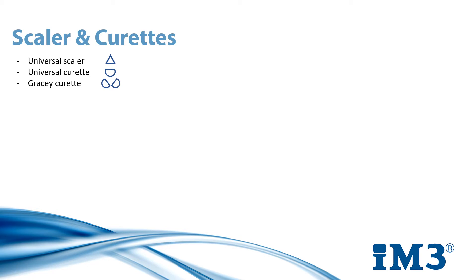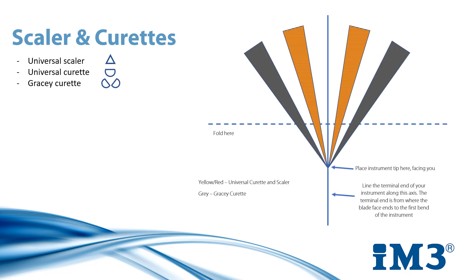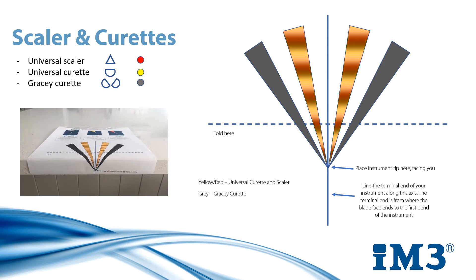Because each instrument has different angled blades, they need to be sharpened accordingly, and that is where the IM3 sharpening guide can help. This chart has been developed with an easy color-coded system to help you angle your stone correctly against the relevant blade face. It can be conveniently folded around the table for quick access when sharpening after each procedure. To use, the tip is placed at the point on the chart where all lines meet. You then line the terminal end of your instrument parallel to the axis. The sharpening stone is then positioned at an angle based on the color system: yellow and red for universal scalers and curettes, and grey for Gracie curettes.